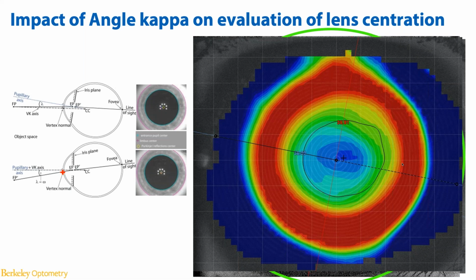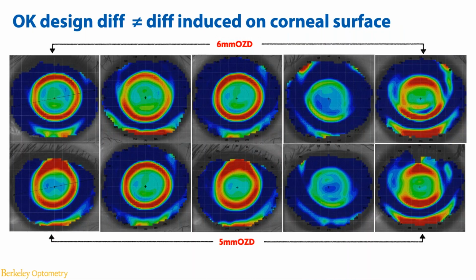Yeah, setting expectations with both the patient and parents is so important. And that actually brings up a good question as well with the 5mm optic zone diameter size. Did your patients in the clinical study notice an increase in glare, or would you be concerned about glare and halo increasing in patients in this design?